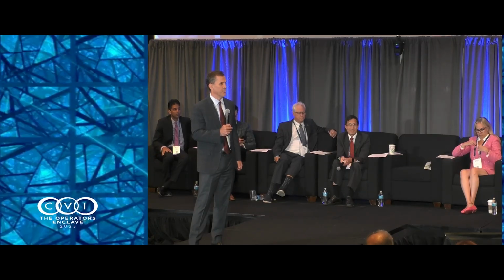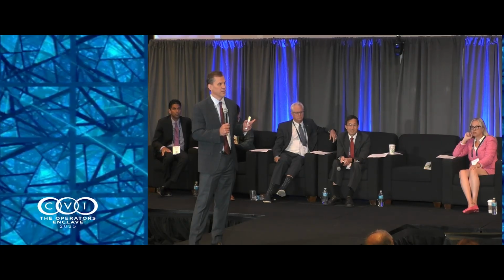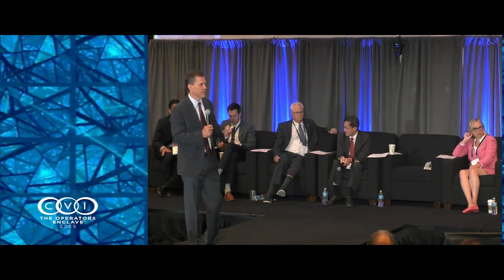So the question about PET scanning, and I certainly think non-invasive testing is helpful. One of the limitations of non-invasive testing is that we cannot calculate pure microvascular resistance because we don't have the distal coronary pressure. We can calculate, like you said, coronary flow reserve, which is nice. You have to be careful because there are different endotypes. You can have high resting flow that leads to a low coronary flow reserve, and I think we're still trying to learn whether that is true microvascular dysfunction or not.